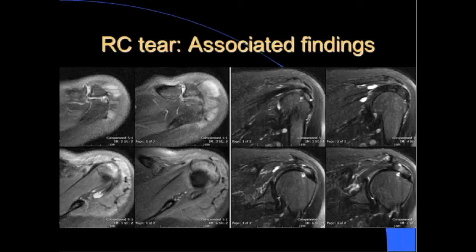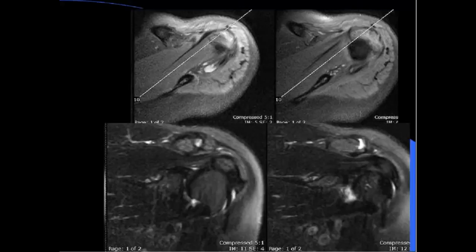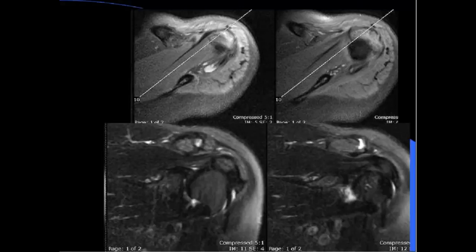When looking at oblique coronal images, make sure the technologist obtains them along the long axis of the supraspinatus tendon to best visualize tears. The patient should be in neutral or slight external rotation, because internal rotation masks the anterior fibers of the articular surface.